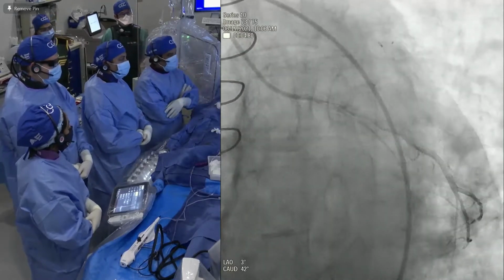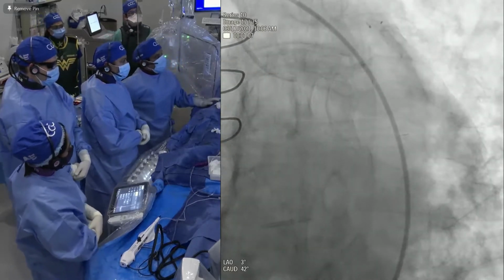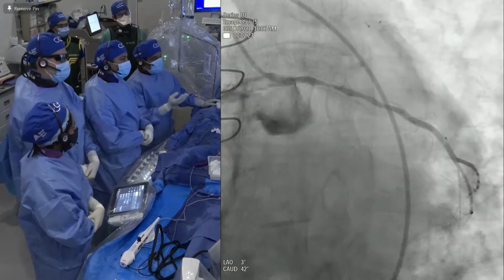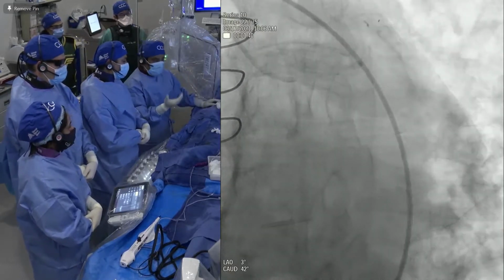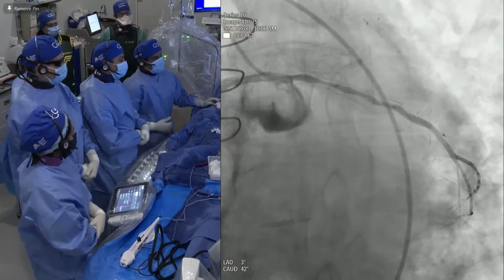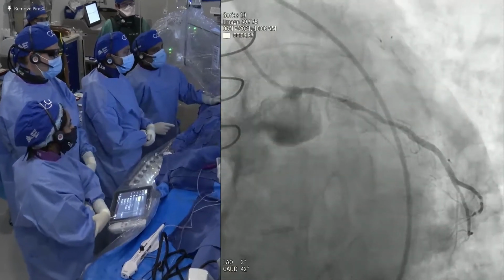This is just about a few weeks ago. So the patient has now been referred to me, asking what to do. Clearly, can we do an atherectomy, rotational atherectomy? We felt it's a good case of unexpanded stent, where you can use various techniques, starting with a laser, rotational atherectomy. A high pressure balloon or cutting balloon won't help in this situation. And IVL had already been tried and they could not expand this. So IVL was done post-stenting, but not pre, and there is a lot of calcium there. So anyway, we are here.